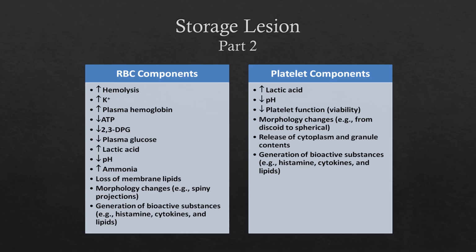So just be aware that these changes do occur in stored blood, and that sometimes when a hospital requests fresh units for a certain patient population, they have their reasons, because the storage lesion can affect outcomes in certain patient populations, and it makes sense to be aware of that.